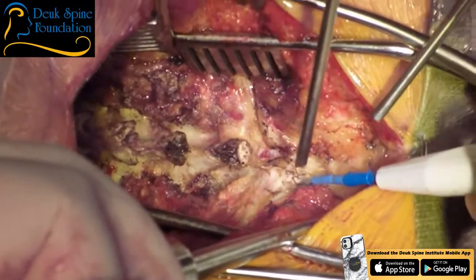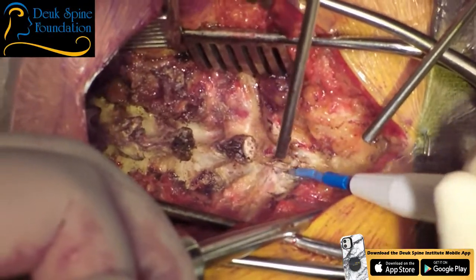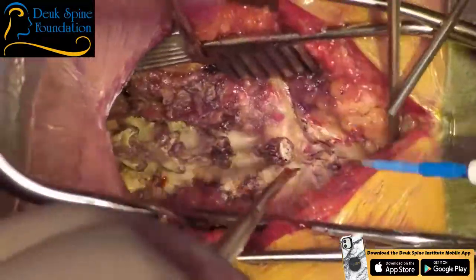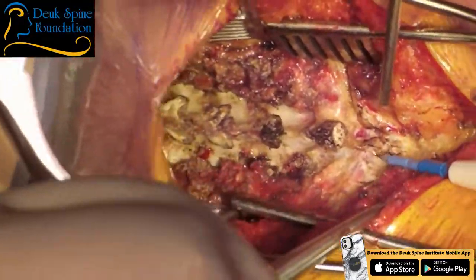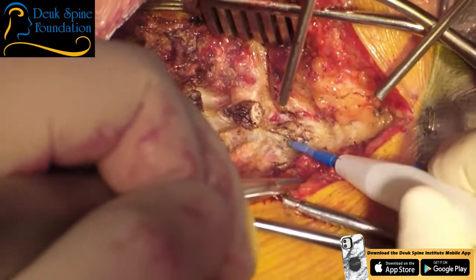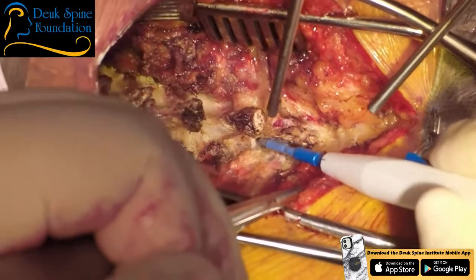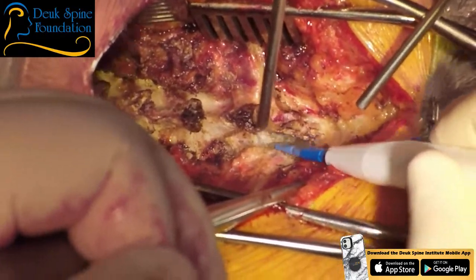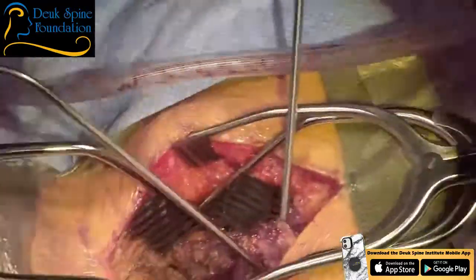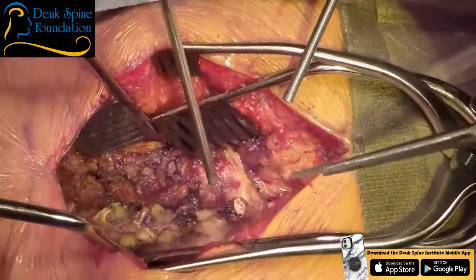All right, I'm going to be able to get my retractors deeper in just a moment. Now let's see what we can do here. Again, this is a tough surgery because of that patient's amount of soft tissue, okay? I'm saying it in a nice way, but bipolar. There's a lot of soft tissue, which means we have a super deep wound.